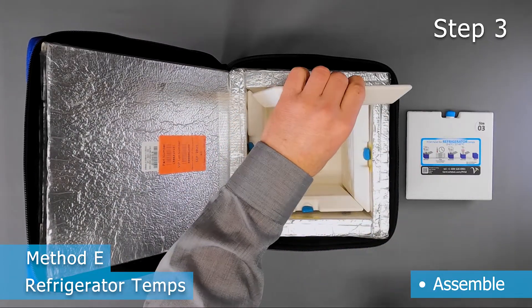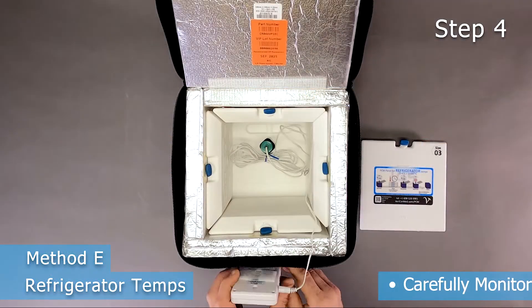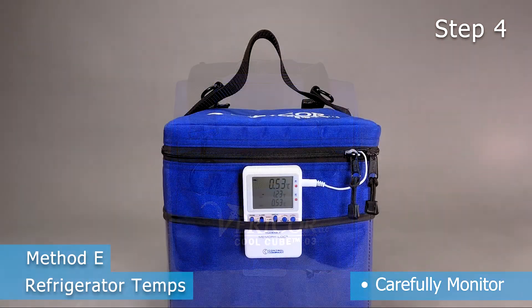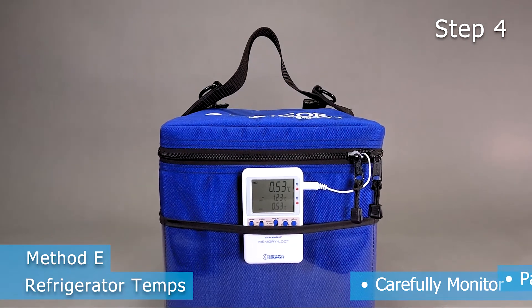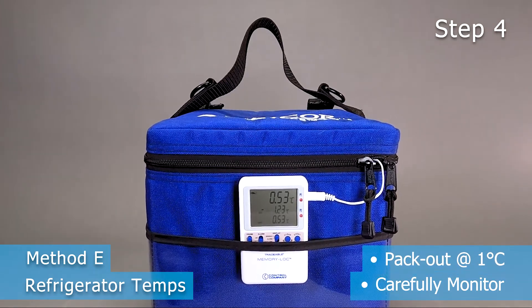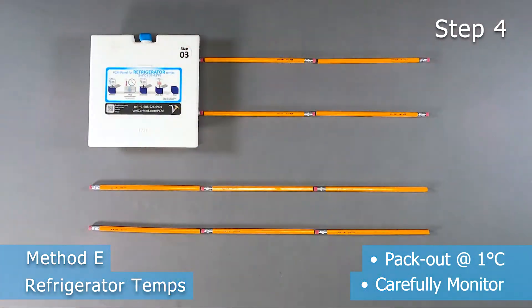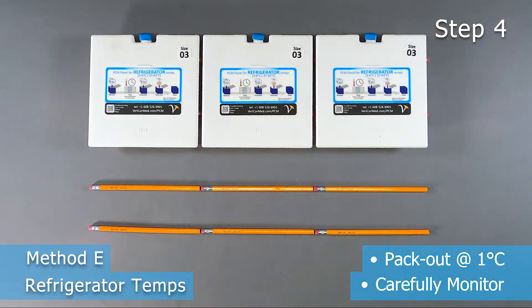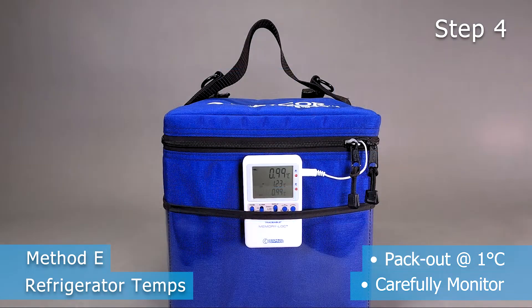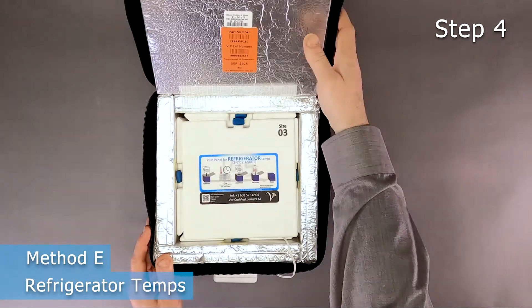Step 4 is monitoring with a certified data logger. Before pack out, insert a thermometer and close the case. Carefully monitor the CoolCube. The optimal temperature for this stage is reached when the thermometer gets to 1 degree Celsius. If the temperature is below 1 degree Celsius, wait until it warms up to 1 degree before packing out. To speed up the process, transfer the panels into a room temperature environment for a couple of minutes and recheck. Packing out at 1 degree Celsius will ensure a maximum hold time between 1 and 6 degrees Celsius.